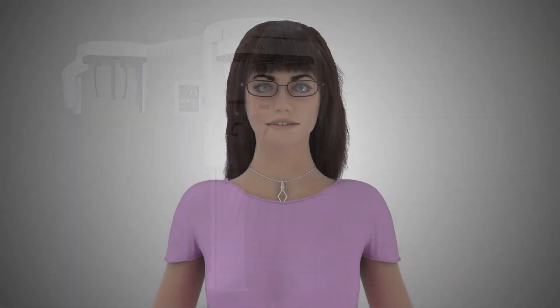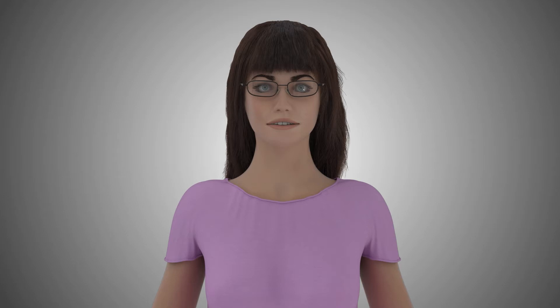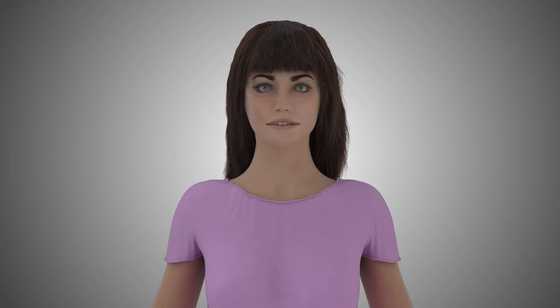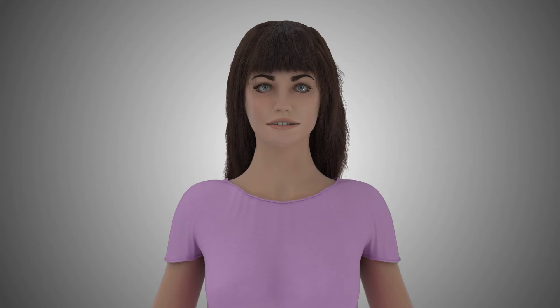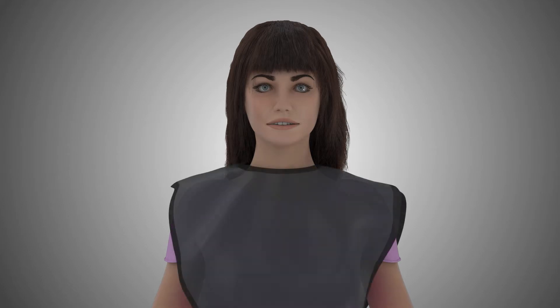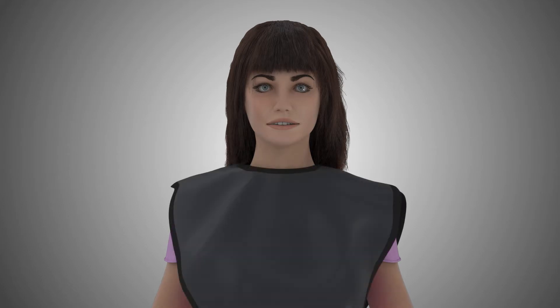Prepare the patient for the procedure by asking them to remove any metal artifacts, including earrings, necklaces, hairpins, or removable appliances from the shoulders and above. Properly place a protective lead apron over the patient in accordance with your local regulations.